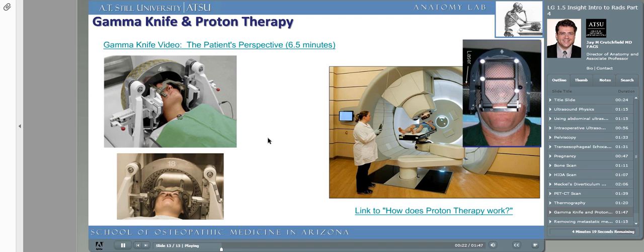The patient's head or body must be fixed in a metal cage to prevent movement, or the skin is tattooed, so the beam is aimed at the exact same spot with each and every treatment. Occasionally, you may run into patients who have tattoos on their forehead or on the sides of their head or any areas of their body. These patients are receiving some sort of gamma knife therapy.